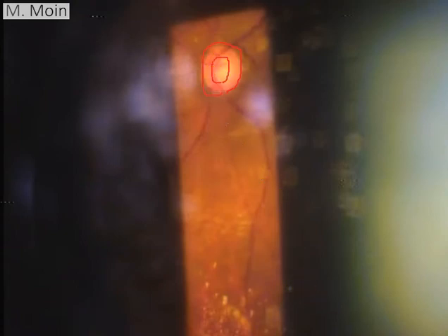This is the cup to disc ratio which you want to see, and this patient probably has a cup to disc ratio of about 0.6. There doesn't seem to be any nasalization of blood vessels, so it seems to be more of a physiological cup in this patient.